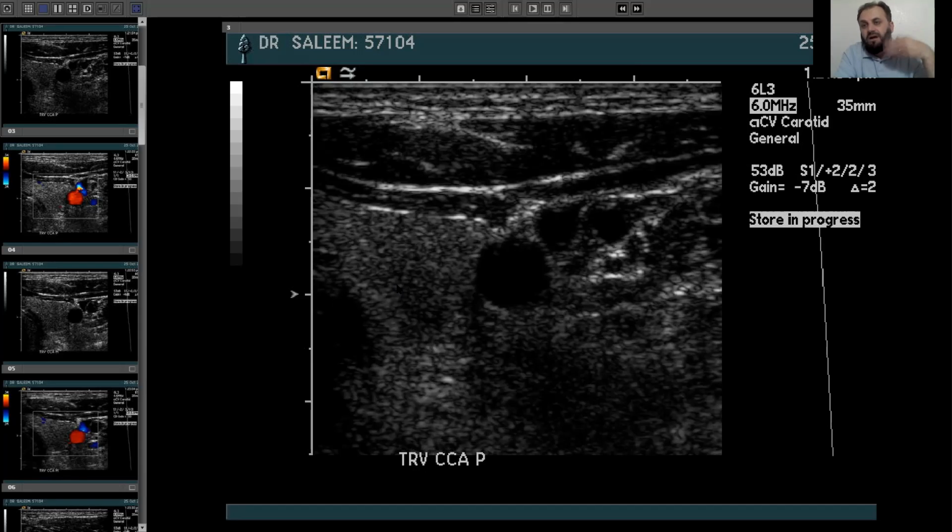If somebody has a tall neck, you may not see the thyroid tissue, because you may see only a circular, nice, anechoic CCA with clear borders and a gray shape, with a little bit of thyroid tissue or maybe none. But we have to distinguish between the proximal CCA and then the mid or middle of that CCA in the next image.